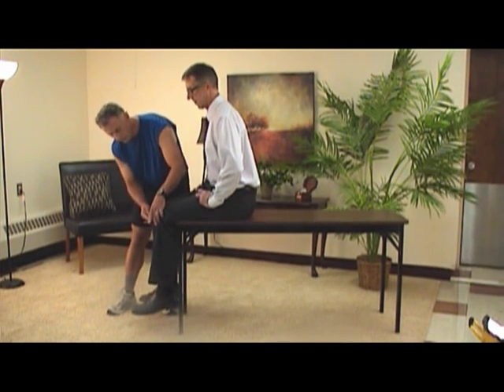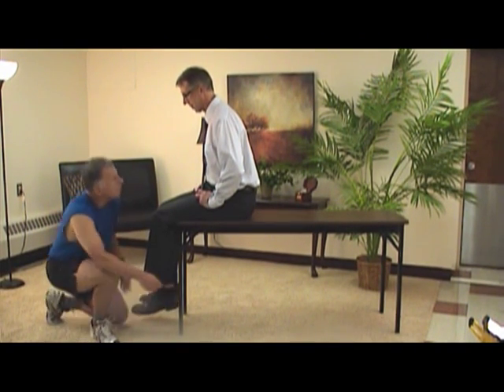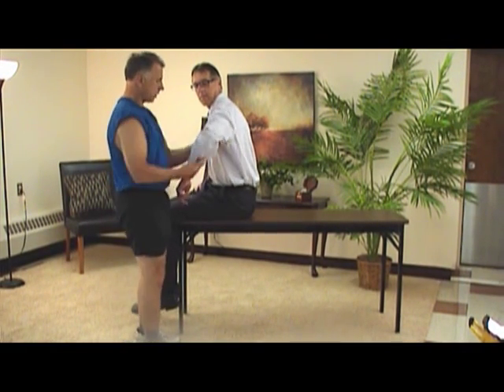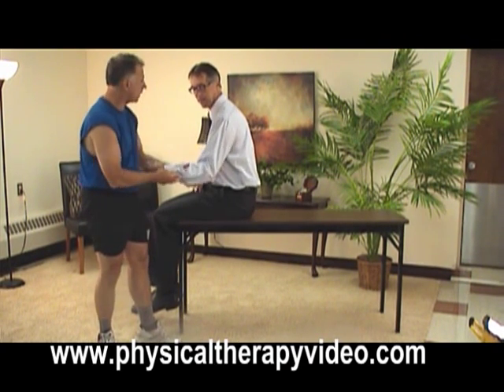So we can do the reflex test here, you can do it on this tendon here. It's very common as well. You can put the arm like this on the tricep, and we can do it here, we can do it on the bicep here, we can do it on the brachioradialis. There are a number of spots you can do the reflex.